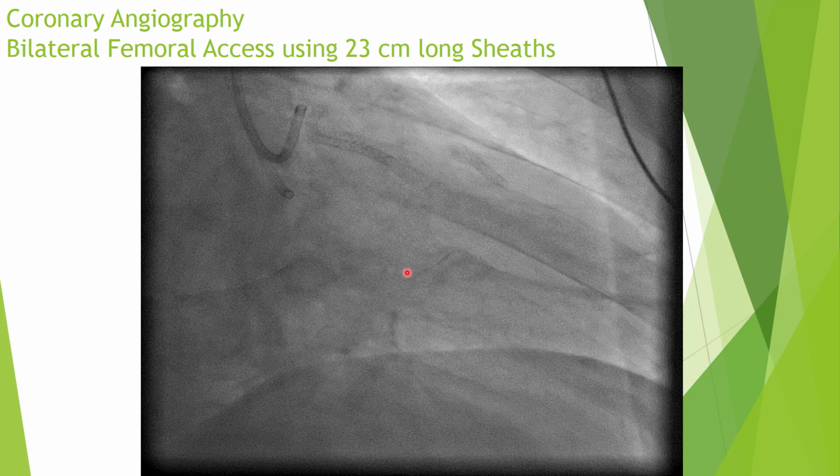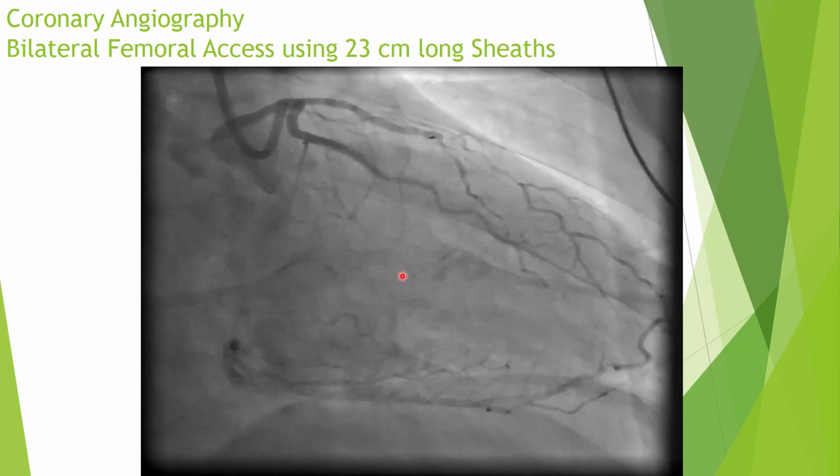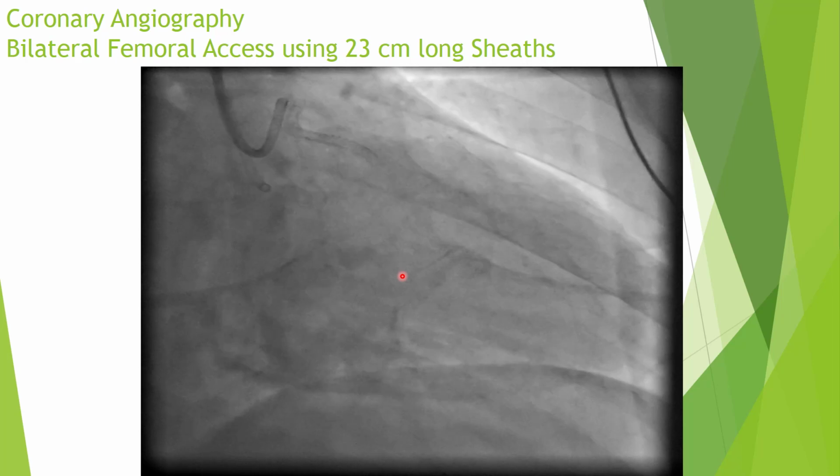How do I run this? So this is a double femoral approach. How do we do that? Oh, sorry, it's not working here. Anyway, so double approach, you will see, can we run it more? You will see the LAD stent totally occluded. It's a mid-LAD stent. The RCA. Can you rerun the loop again, please? Anyway.